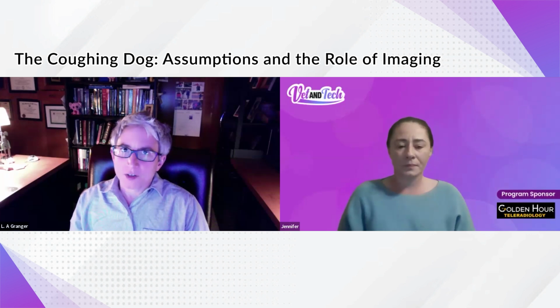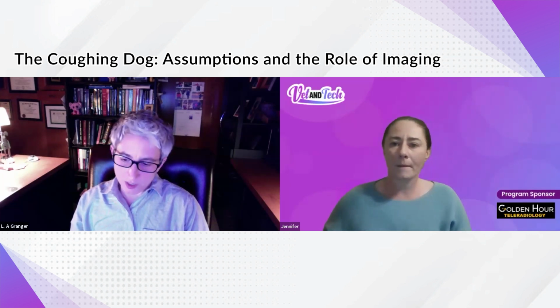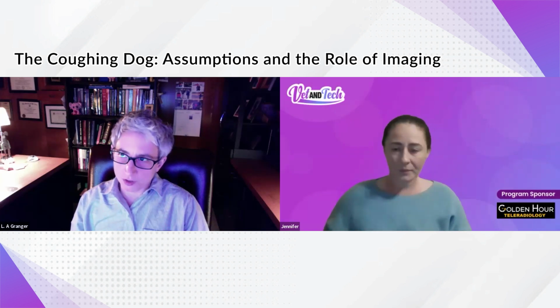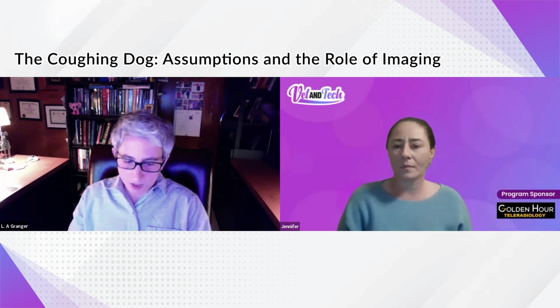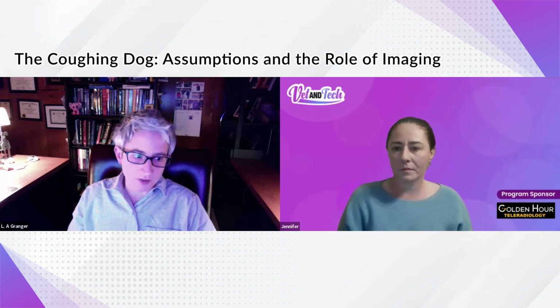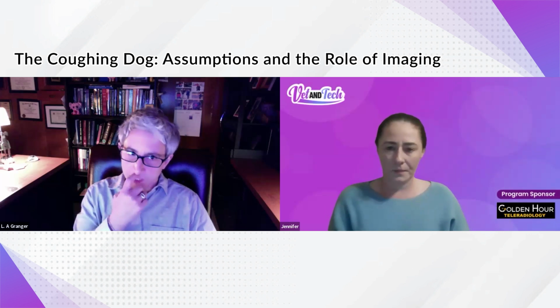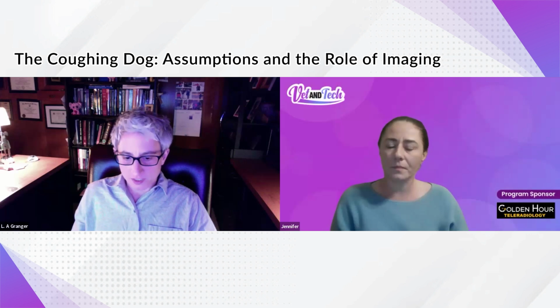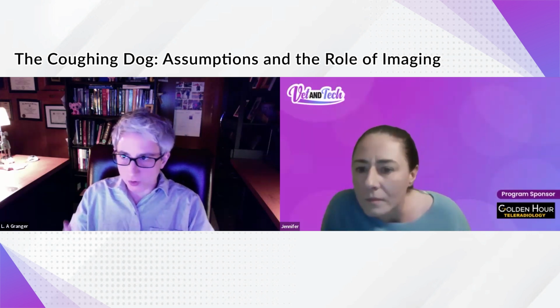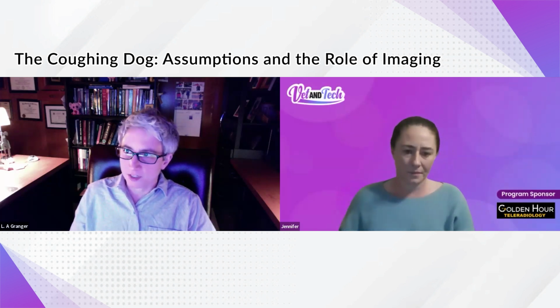The metric for it is that if you have a bronchus and a bronchial tree, the closer you are to the middle should always be the biggest in diameter. So if it is not tapering throughout its length, either through a section of it or a portion of the lung or a single bronchus, it is then considered dilated. What a limitation of radiographs is, though, is given that it's a 2D image of lungs, it makes it difficult to see mild dilations.